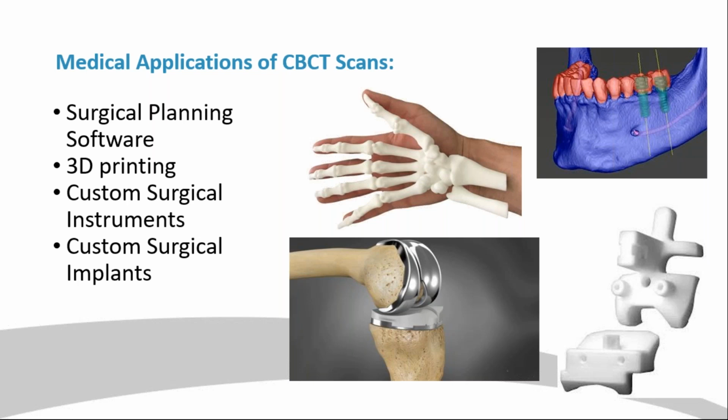And it's really changing how people look at very complex cases to improve their surgical approach and their efficiencies. Another area that the scans are used is in custom surgical instruments. So our company, Curvebeam, has specifically gotten into this recently. On the bottom right corner, these are the cut guides that Ian mentioned as well, to just further elaborate. These are the ones that are used for an ankle replacement.